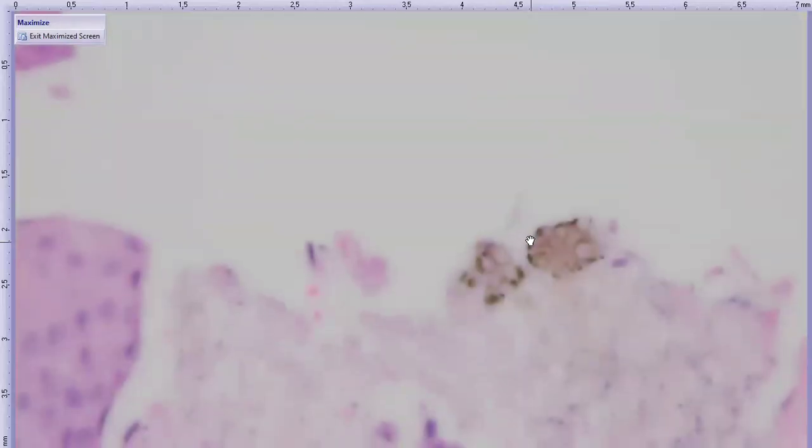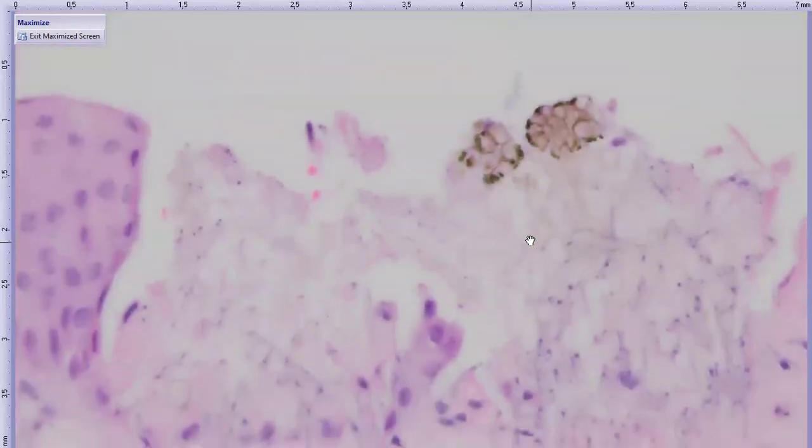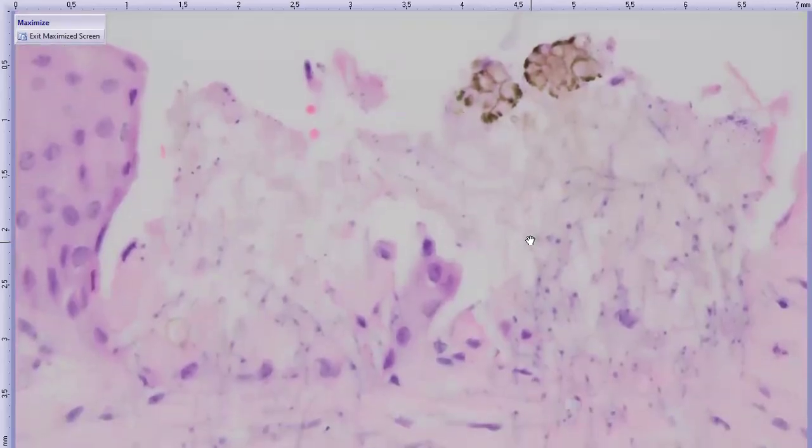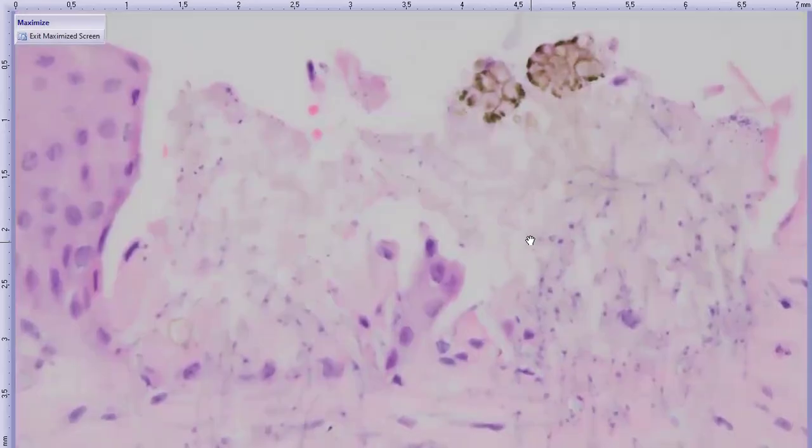We did wonder, since the dog was diagnosed with bilateral KCS, if the dog has been on immunomodulatory treatment, and so that could explain the lack of inflammation. So some nice conidia here, a little bit of branching, a little thinness, that stuff.